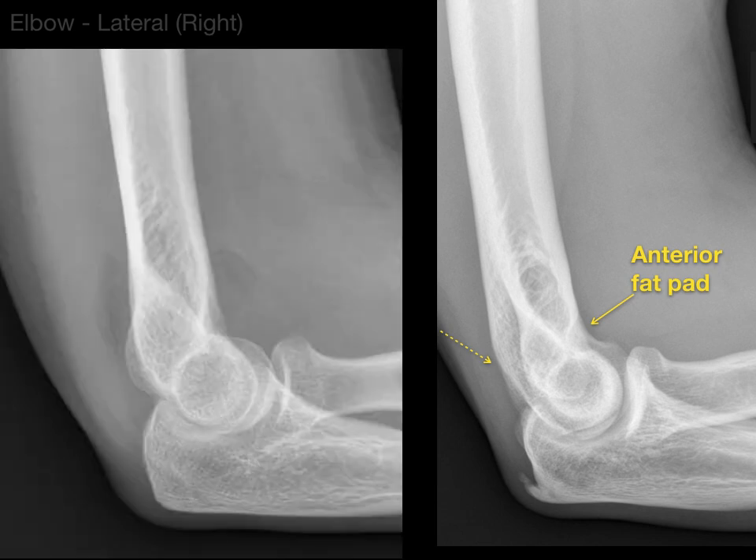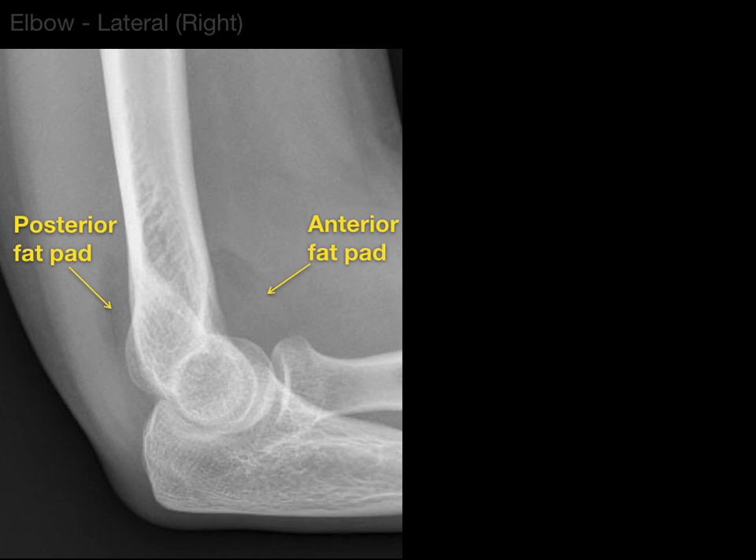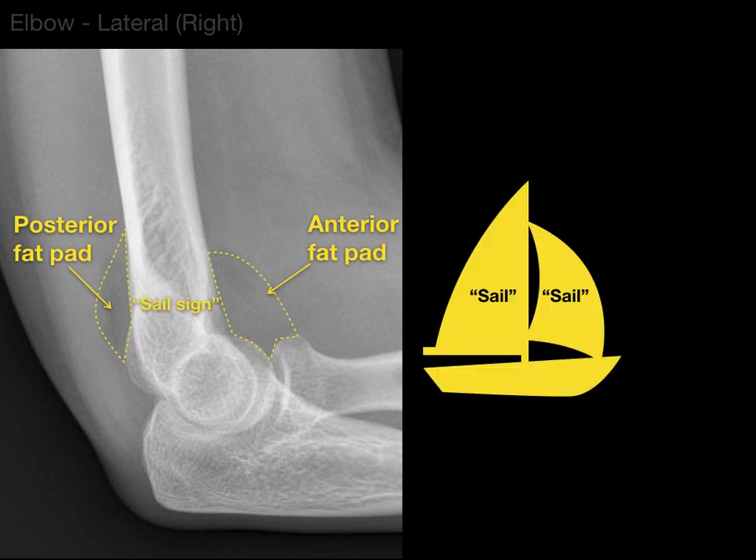What happens is, if you see really dark swelling in the front and in the back of the elbow, that means it's not as dense because it's fat compared to the surrounding muscle. These are called the anterior and posterior fat pads. They call this the sail sign because it looks like sails. This is where you have some type of joint effusion — blood or excess fluid — pushing these fat pads out from their hiding spaces in the olecranon and coronoid fossae.